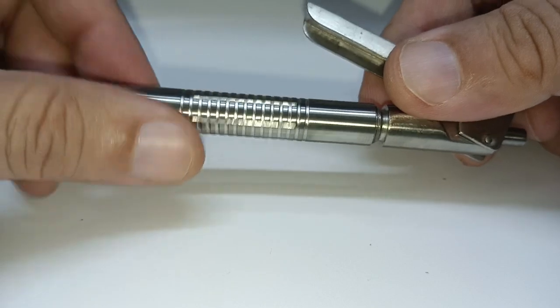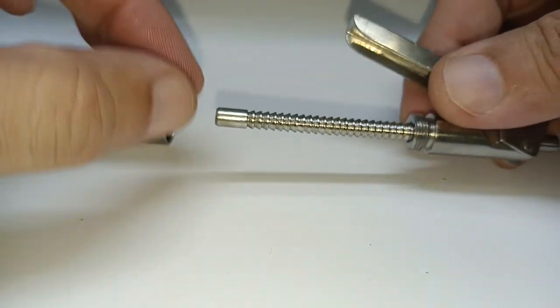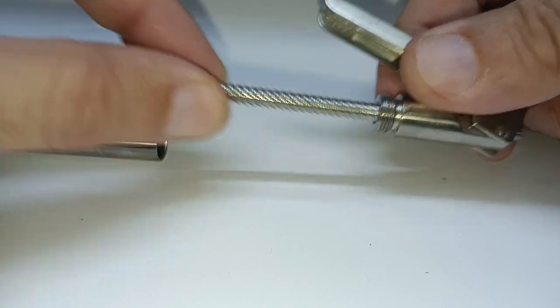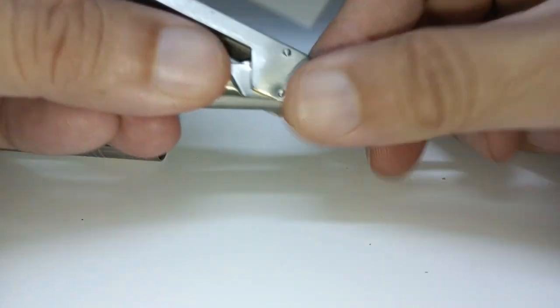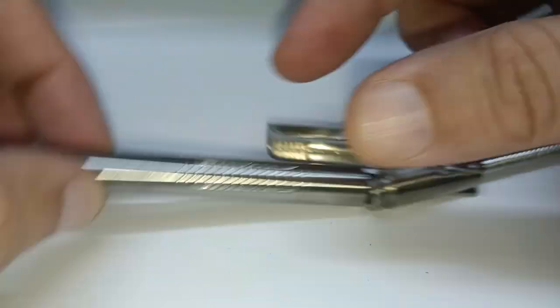So with six clicks you should be able to get the whole tooth numb very nicely. You should be able to work peacefully in that tooth. In order to redo it, you would need to reassemble it in this particular model and reinsert it in the back, and you will have to tap out the local anesthetic ampoule and insert a new one.